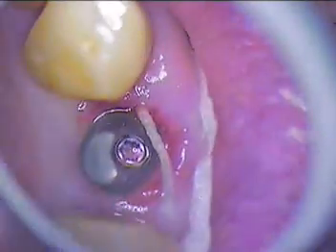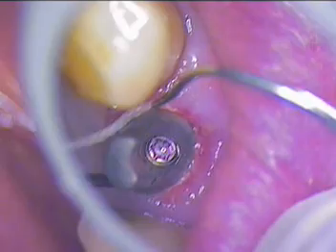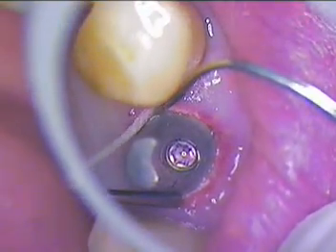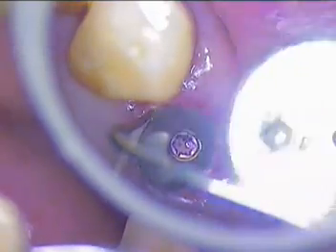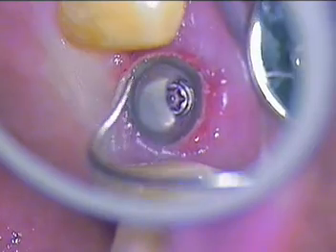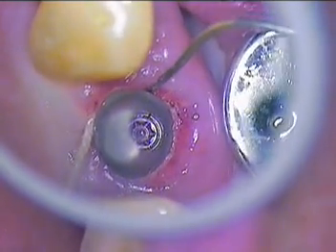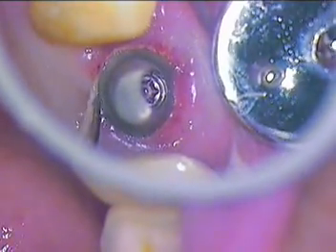Hello everyone. We're getting ready to cement the bone level crown now and I'm placing retraction cord. This is number seven Siltrax cord and we're also using a small suction device that helps with this part of the procedure. The reason I'm doing this is because so many dentists are having a hard time cementing their crowns and trying to get through without causing any peri-implantitis — so this method prevents it.